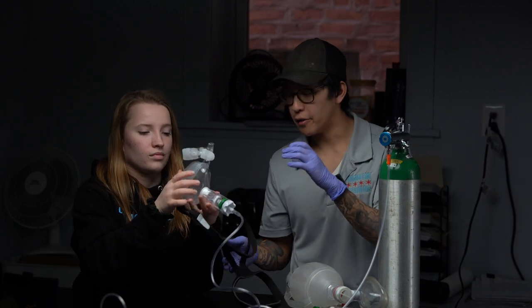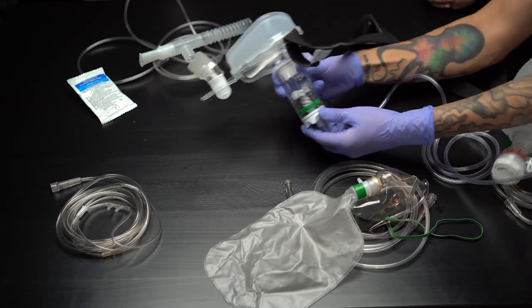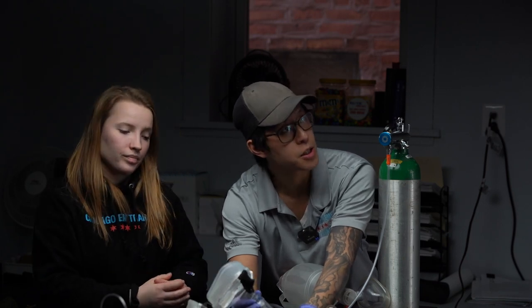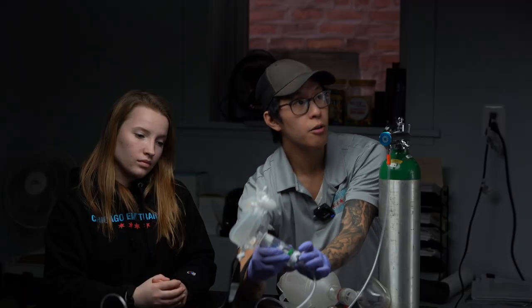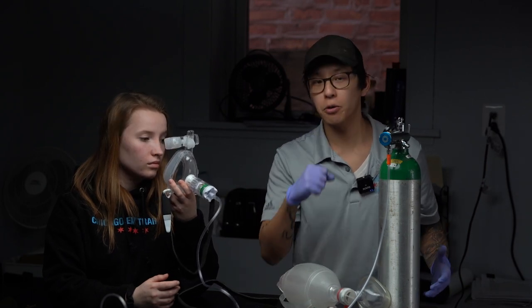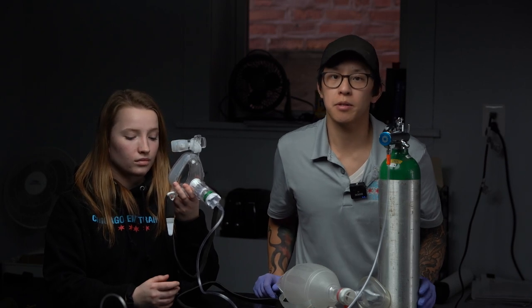What I would do is turn it on and then give it to my patient. I would coach them: just hold it to your face until you start to feel comfortable. If you look at this part down here, we can adjust this green lever. The numbers are 5, 7.5, and 10, and we start at 5. All these numbers correspond to the level of PEEP — positive end expiratory pressure — that the patient is experiencing. We adjust this and raise the level of PEEP until the patient starts to feel comfortable. We allow the patient to hold it to their face, giving them some level of control so they can pull it away if it's too much, or continue holding it if they start to feel comfort and less shortness of breath. After they've gotten used to it, we can start applying the black straps to the back of their head.